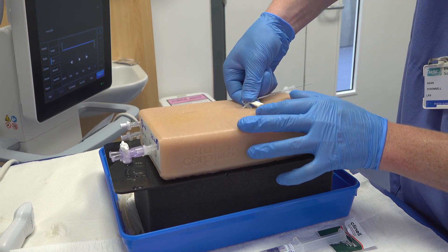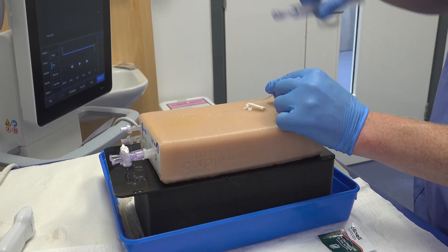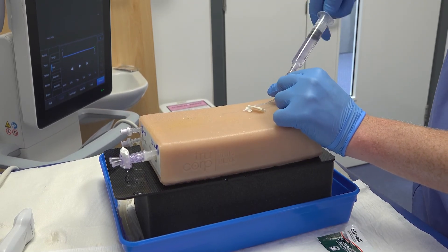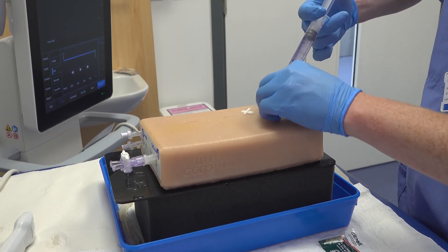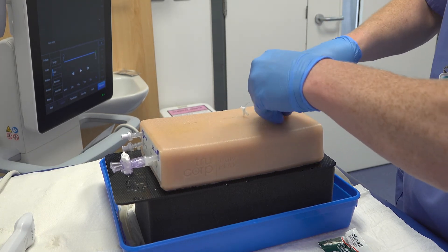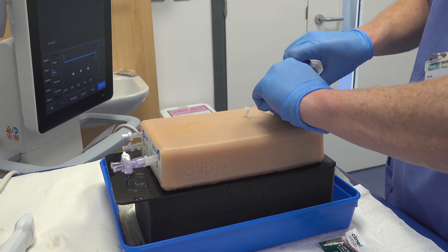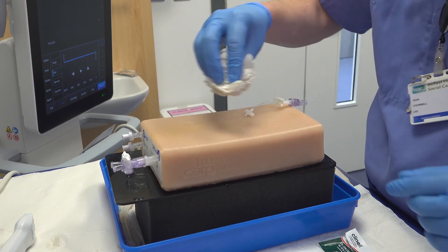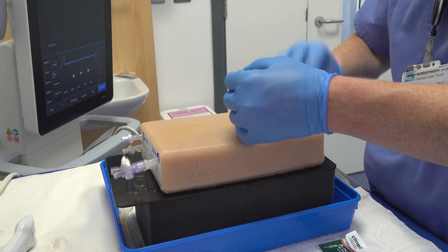I advance the line up the vein. When I am happy I remove the guide wire and place a pre-flushed connector onto the line. I clean and dry the surrounding skin. In this case I will use two teddy bear dressings back to back for securing the line. Aspirate and flush the line, then clamp it, place a bandage and document the insertion.